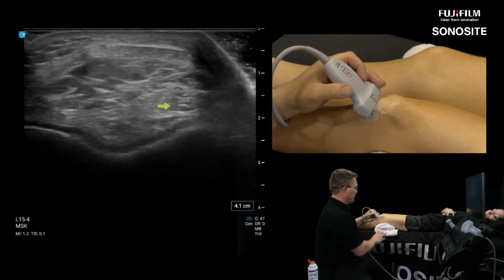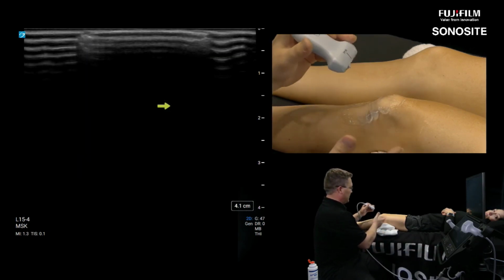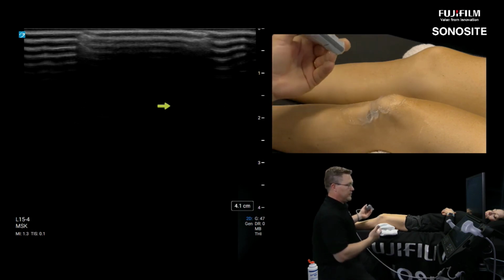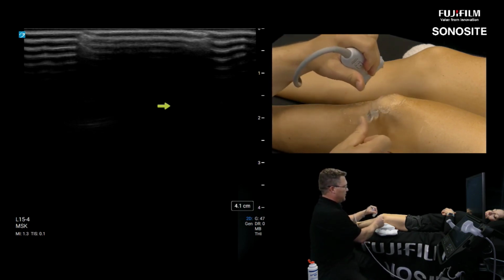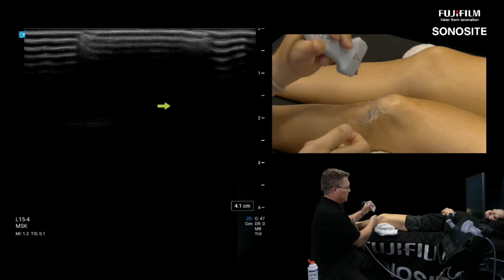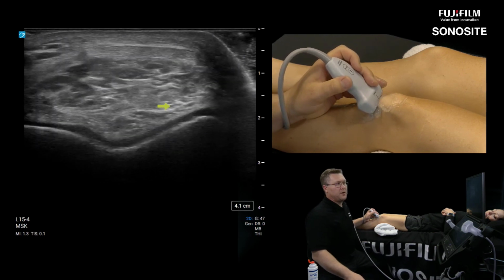Two, the blind landmarks are not quite as obvious as you would think. If you look at all the literature, the approach should be that her knees are hanging off the side of the table. You don't even use a transducer in a blind approach. You palpate medially and laterally, feel Hoffa's fat pad on either side of the joint line, and you drive your needle. Some people go ahead and hit a little bit of bone and back off.